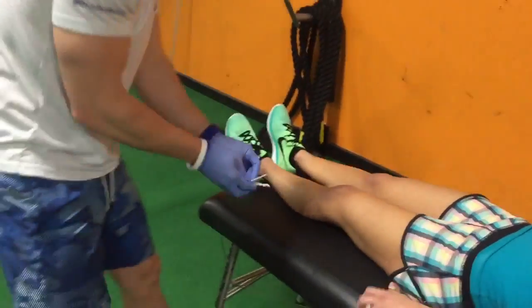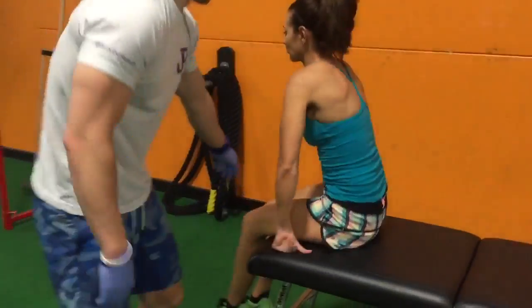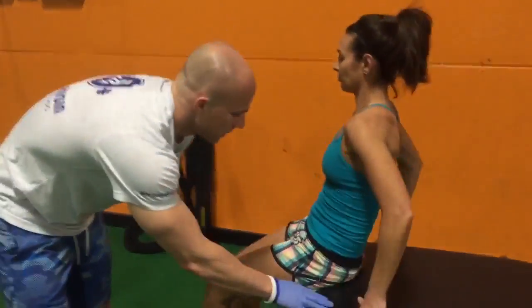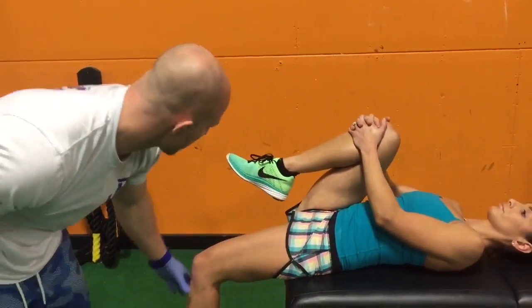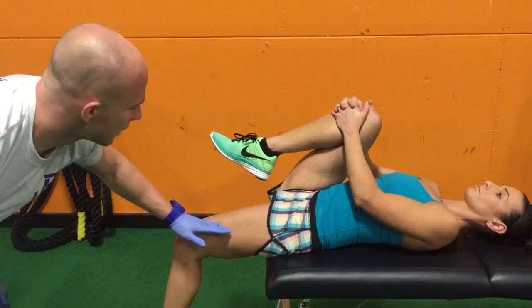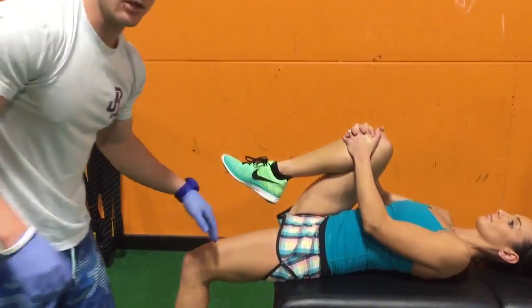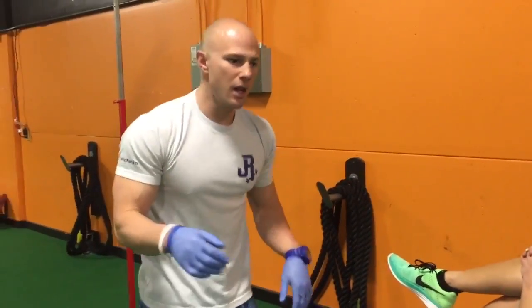Lizzie, come back up — we're going to get into that Thomas test position with your sacrum here. Bring your right leg up to your chest, come a little bit more towards me, and let the leg relax. You can see the angle change here from just the musculature that we worked on. And just to be clear, we're not breaking up scar tissue here — this is a neurological phenomenon of musculature reducing its tone.